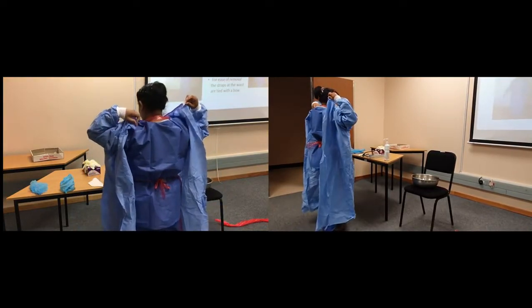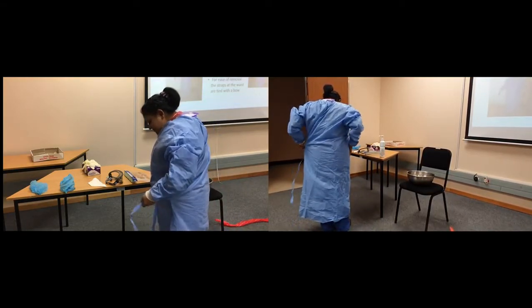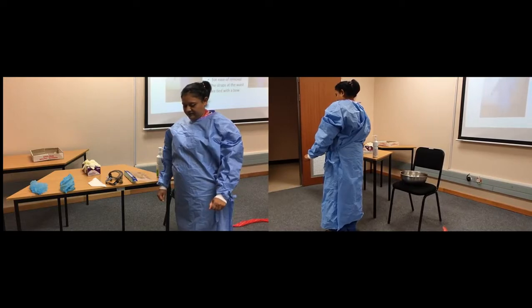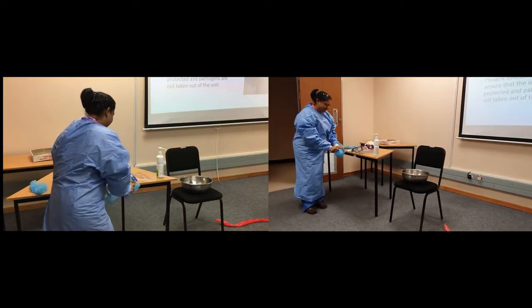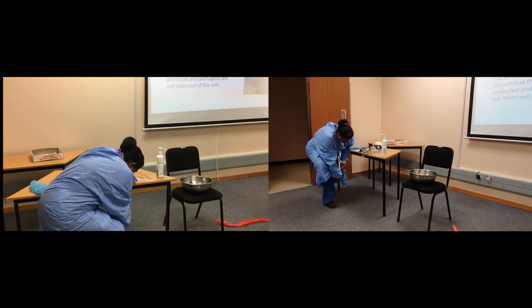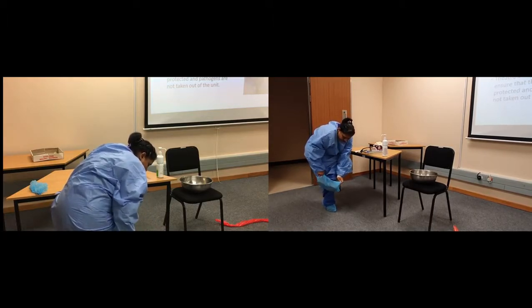The back of the gown has a Velcro strip which she'll close at the back of the neck. Then she folds that flap over and ties those ties on the left-hand side using a bow — a bow makes it easier to get the gown off when finished. These gowns give full protection at the back as well. Then she's going to put theatre overshoes on. If you have shoes with shoelaces, make sure the shoelaces are tucked into the boots. Because it's droplet spread and droplets fall to the floor, this protects your shoes when in the unit, and you take the boots off before you leave.